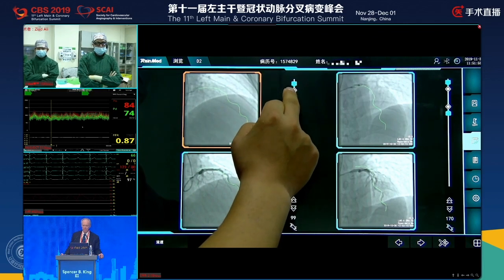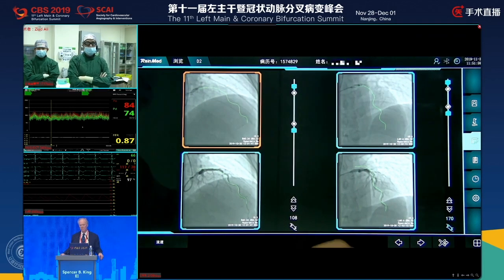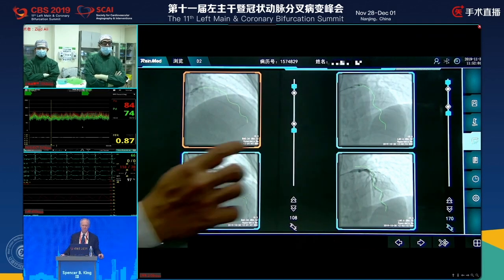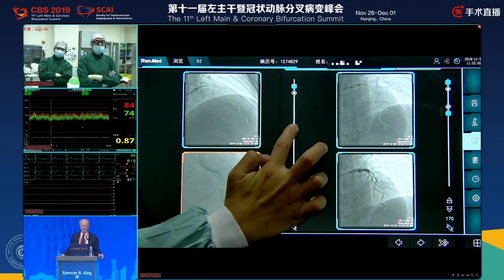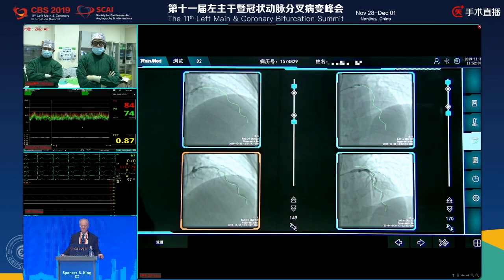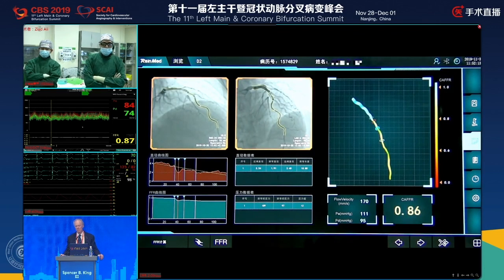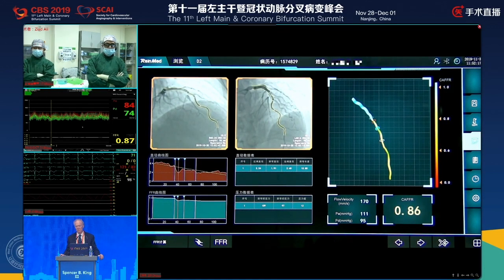Okay, select that, and then go ahead. And then distally, we show the first frame where we see contrast going into the distal coronary artery past the lesion. So go ahead and show that, guys. Okay, good. And you do that for both coronary angiograms, and then you press the FFR button. So let's see, go ahead and show us the calculation, just show us how long this takes. Can you press it?